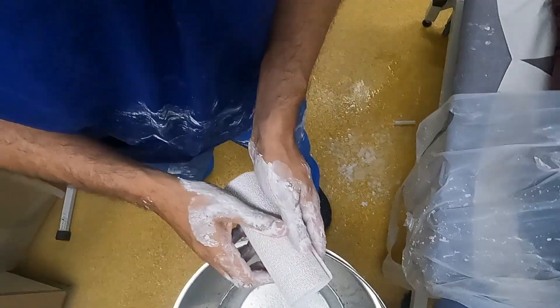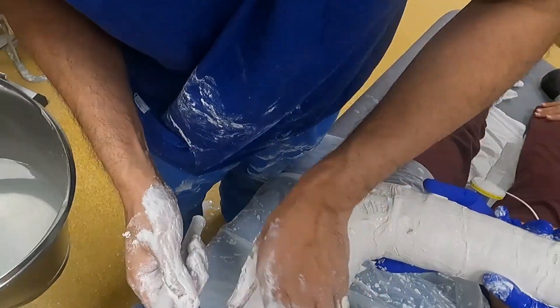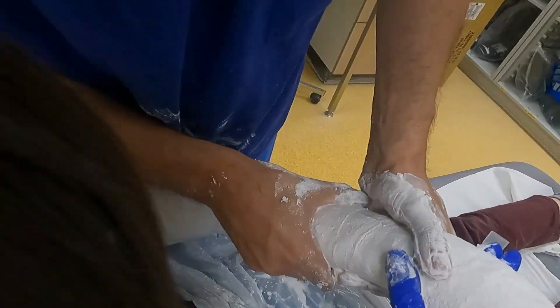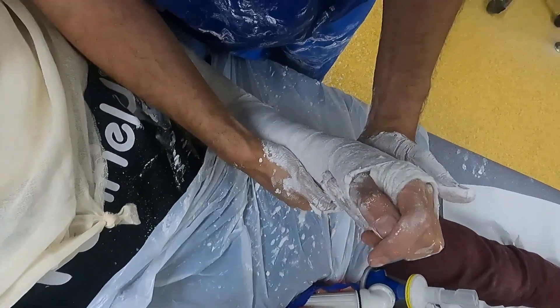This is again completed with a four inch layer of plaster of Paris, then reinforced with two further layers. The elbow is flexed to 90 degrees, and as this was an apex volar deformity, by pronating the wrist this will aid in reduction.